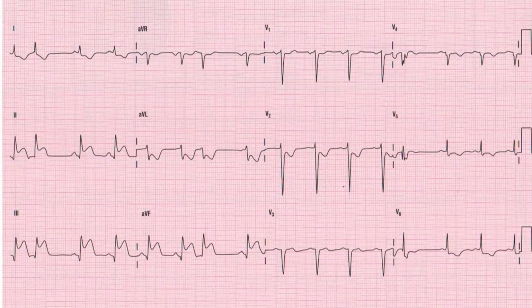Okay, so let's take a look at lead 1, it's depressed. Lead 2 is elevated. Lead 3 is elevated. AVF is elevated. AVL is depressed. V1 is normal. V2 is depressed. V3 is normal. V4 is depressed. V5 is depressed. And V6 is depressed.